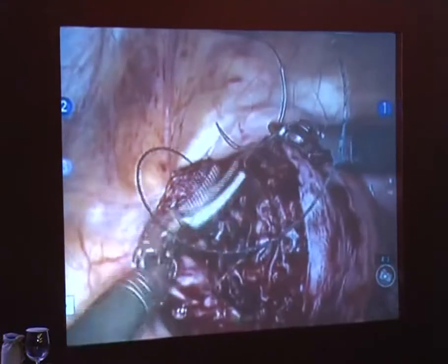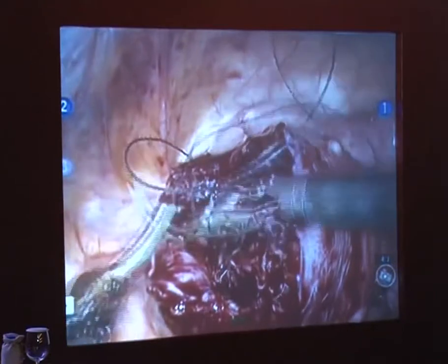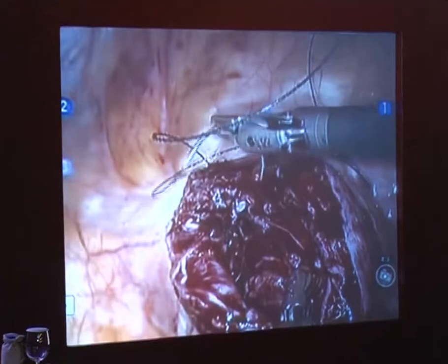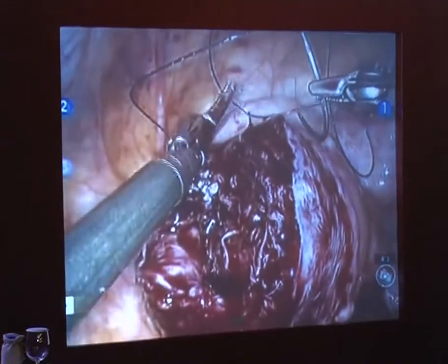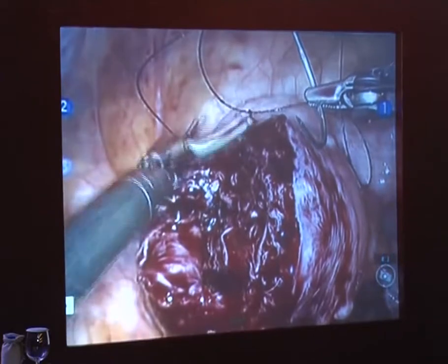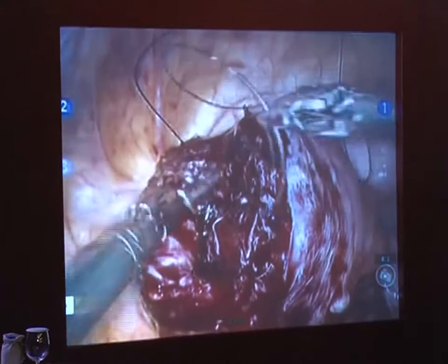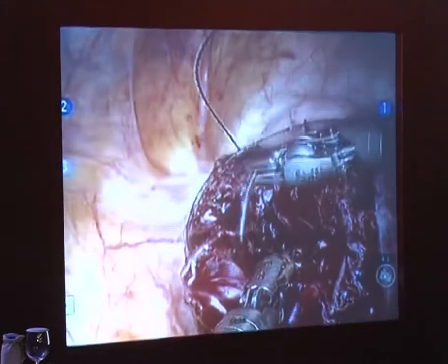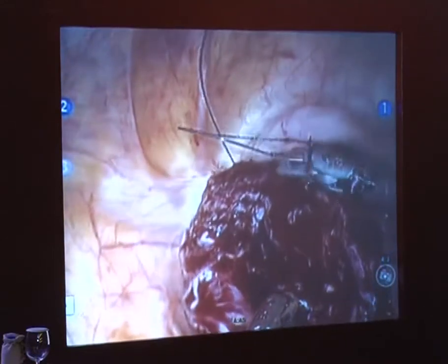All right, that's the first anchored stitch. This is a 12-inch barb suture. It's 180 days. I actually like to use the 2-0 on the myometrium. I actually use it all the way through full thickness, and I don't worry about it being on the serosa. There's been a nice study that came out recently, a sheep model study that looked at the use of barb suture. Go ahead and suction in here.